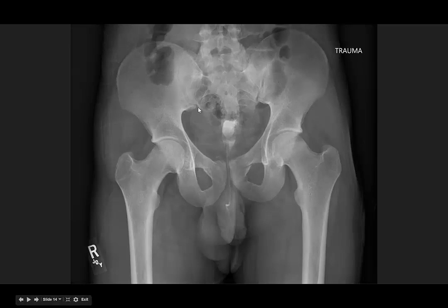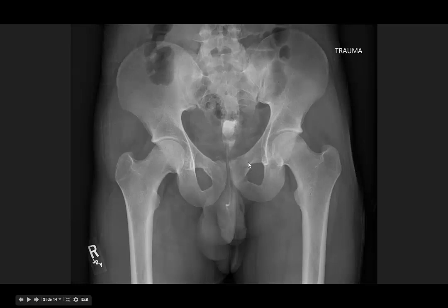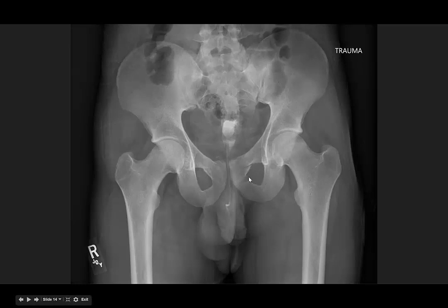Go to your inner ring — there's a gap here, but no large irregularity between where the two bones meet. All the way around. When I first looked at this, it's subtle. The right side is difficult to see, but you can see a little bit of an irregularity. Is that just an offset of the way the patient is turned? It's difficult to say. On the left side, you can definitely see cortical irregularity here, and as you look on the opposite side of the ring, cortical irregularity there as well. You can actually see the lucency through the entirety of the superior pubic rami. Looking at your inferior pubic rami — right there. You can see a small cortical irregularity on both sides.